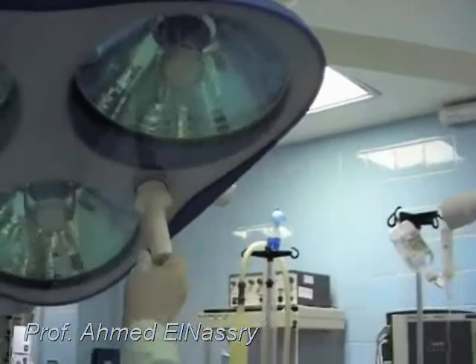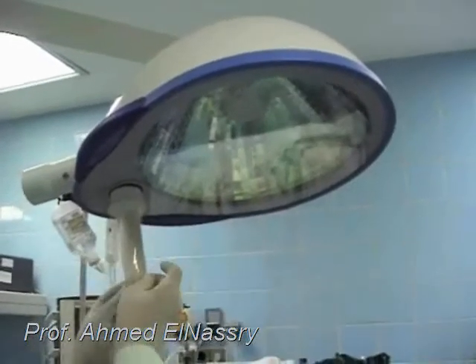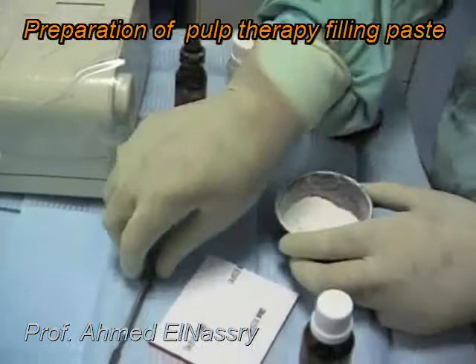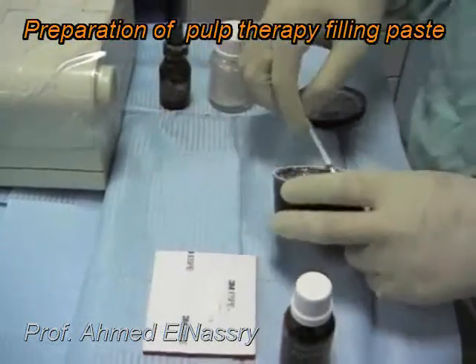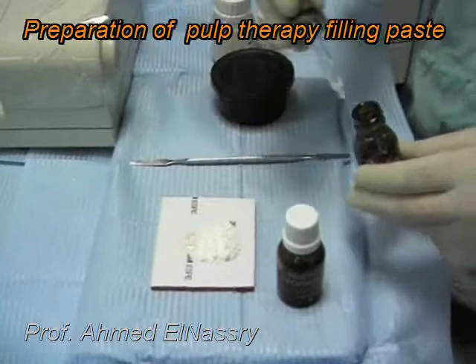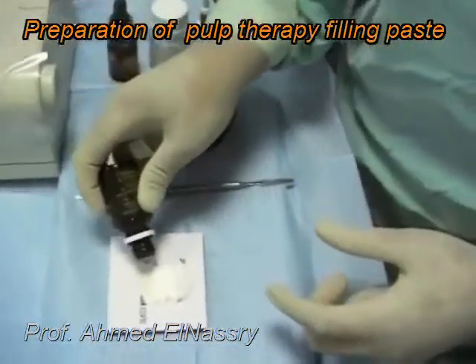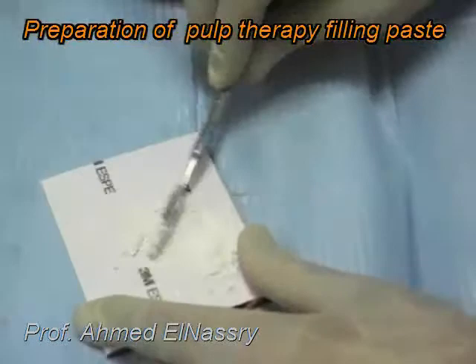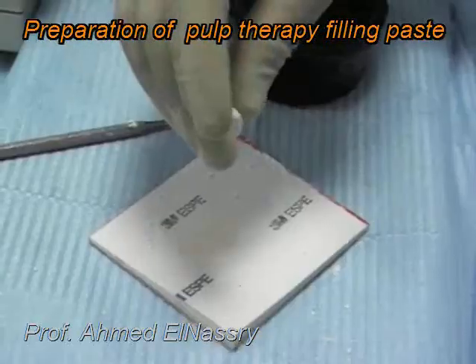Continuing preparation of the operating room: lastly, we cover the light with a protective barrier to ensure safe use during the operation. Also before the operation, we should prepare the medication paste that we are going to use in the pulp therapy of the deciduous teeth, applying the medication and mixing until we reach a homogeneous mix that will facilitate our work during the operation.